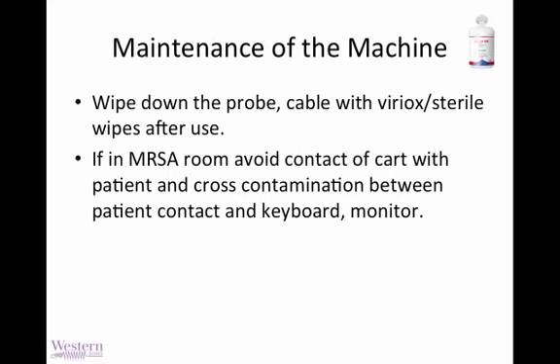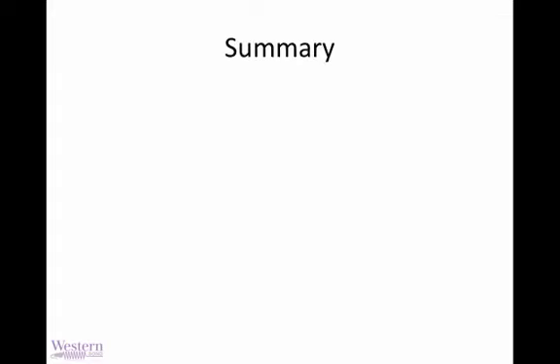Please remember to maintain the machine, especially when it comes to invasive procedures, and especially given the mortality rates that we know central venous catheter infections can produce. So please, please, please clean the machines for the sake of your colleagues and your patients.